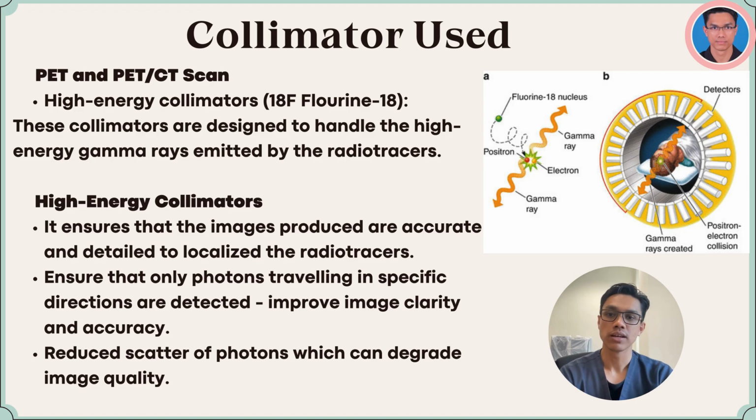In summary, understanding the radioactivity administered, patient preparation, and the type of collimator used are essential components of PET and PET CT scan techniques. These elements work together to ensure high quality imaging and accurate diagnostic information.